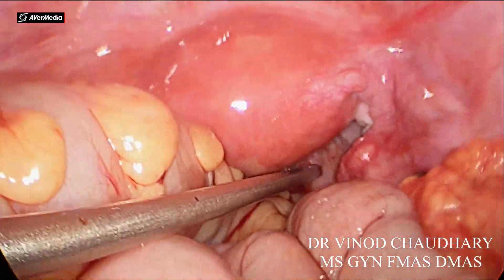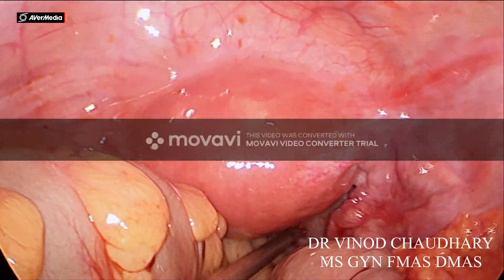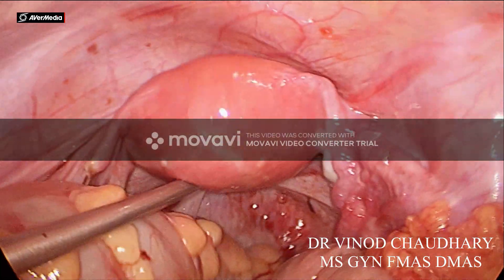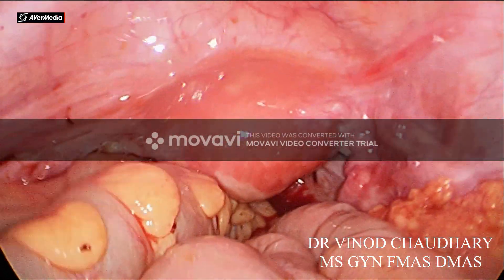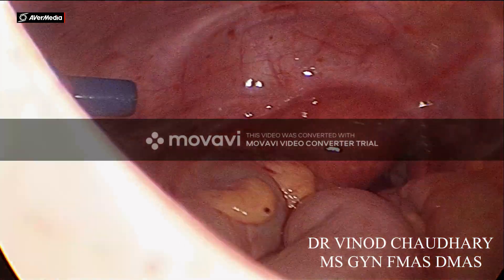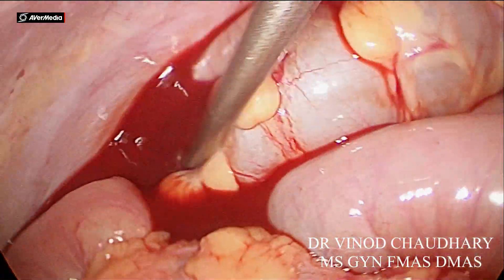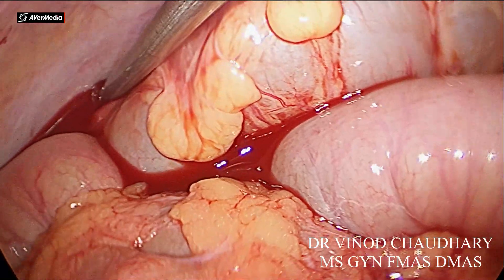It is really difficult to do surgery in this kind of case where the patient was in shock and resuscitated, but still we managed to do it laparoscopically. As you can see, some more blood has collected in the right paracolic gutter.